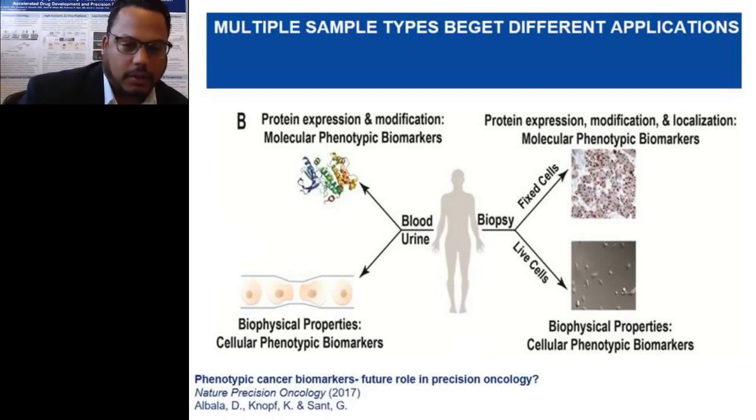And so the point here is that simply live cell phenotypic diagnostics and live cell phenotypic biomarkers can be toggled or applied to various applications within the treatment paradigm, largely, I think, based on the sample input. And the value of these biomarkers is what we'll get into a little later.